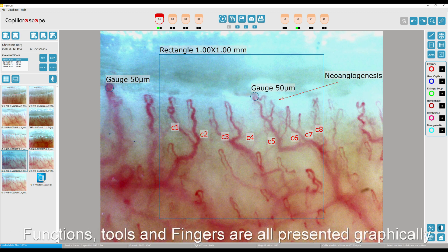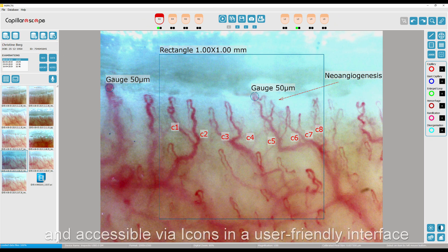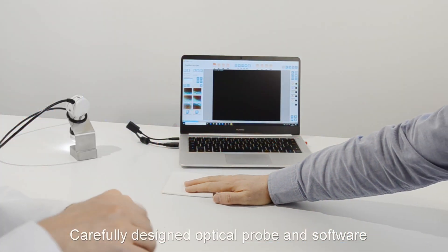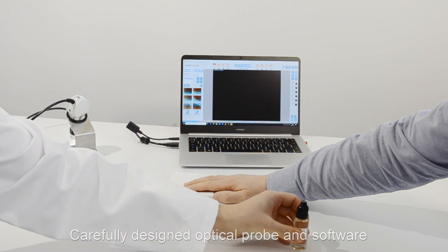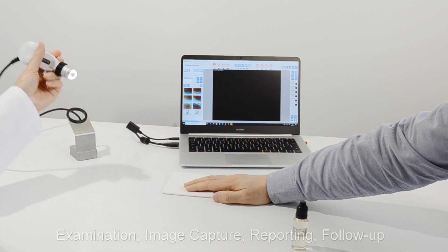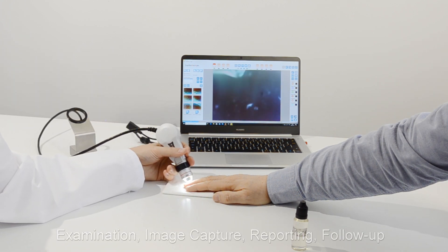Functions, tools and fingers are presented graphically and are accessible via icons in a user-friendly interface environment. The optical probe and software are carefully designed with a streamlined workflow helping to provide efficient and consistent examinations, image capture, reporting and follow-up.